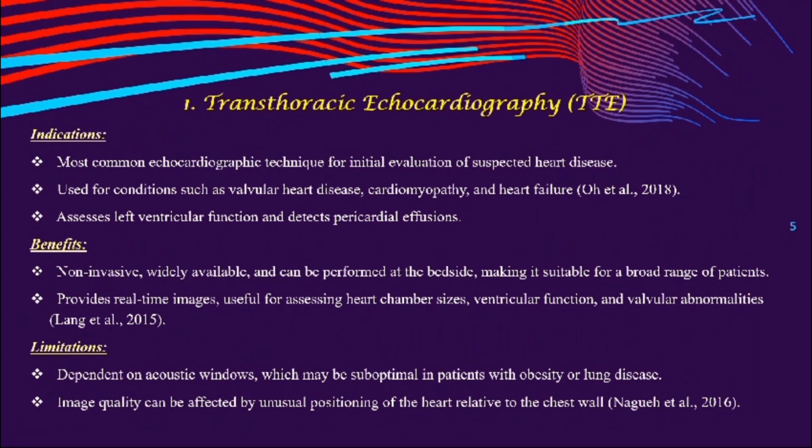TTE, transthoracic echocardiography. Indications. Most common echocardiographic technique for initial evaluation of suspected heart disease, used for conditions such as valvular heart disease, cardiomyopathy, and heart failure. Assesses left ventricular function and detects pericardial effusion.